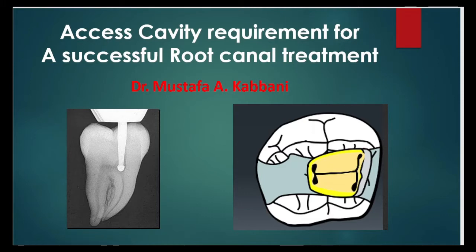Alright, as choosing a topic is always a challenge, I dedicate this lecture to all the dental students and dentists who have difficulty locating canals during root canal treatment. So the topic of today's lecture is access cavity requirement for a successful root canal treatment. The access cavity is the first and the most important phase of the non-surgical root canal treatment. Having inadequate access cavity may lead to inadequate shaping and sealing of the root canal treatment.